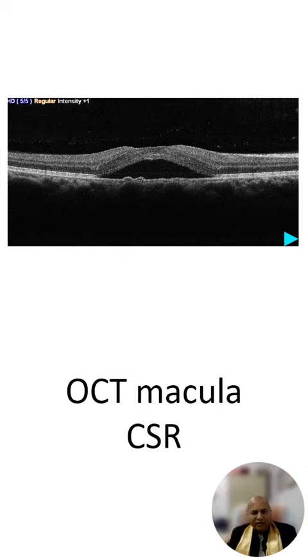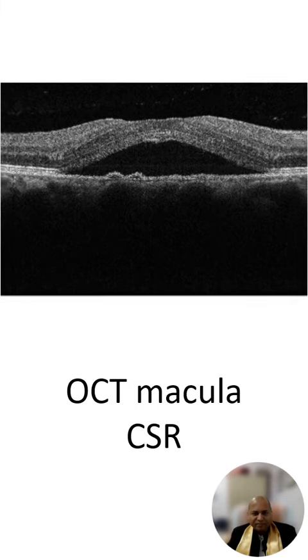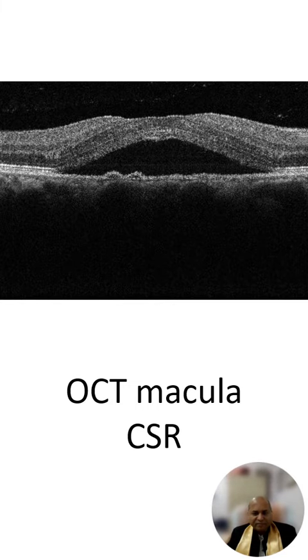The RPE shows some pigment epithelial detachments (PEDs), which are clear fluid-containing spaces in the retinal pigment epithelium with a blister shape. These are the findings you can see in central serous retinopathy in any given patient, although pigment epithelial detachment may or may not be present. Thank you.